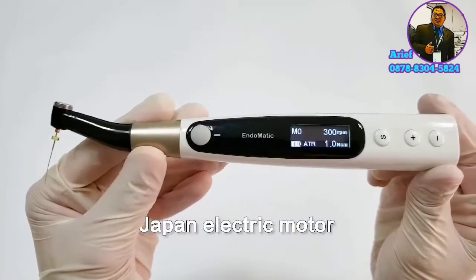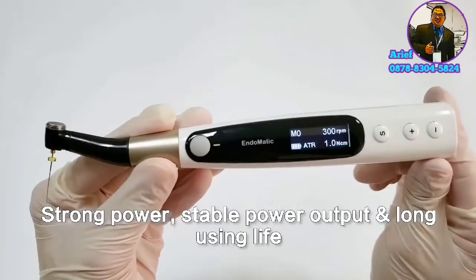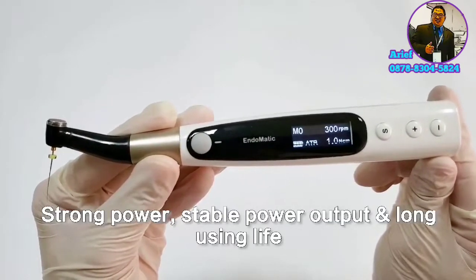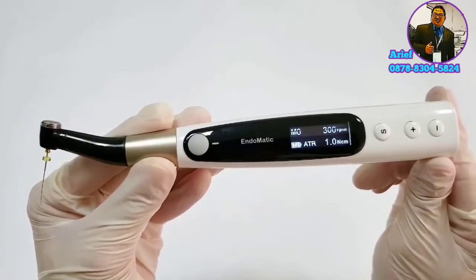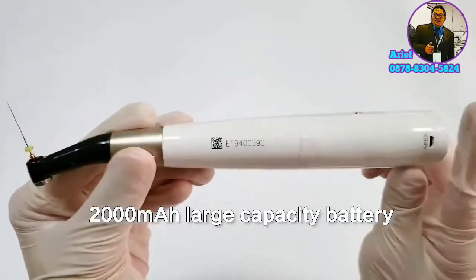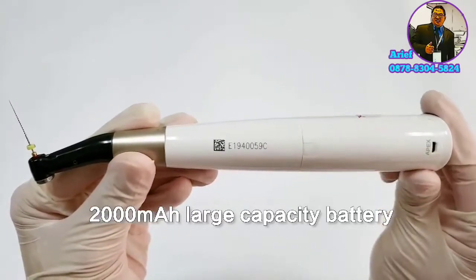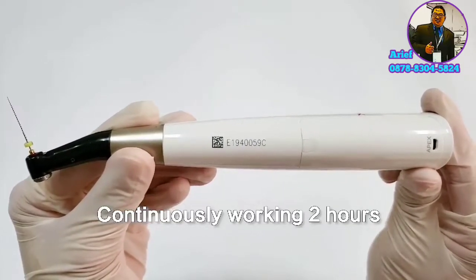Endomatic has a high-quality Japanese electric motor, thereby ensuring strong power, stable output, and long service life. In order to ensure sufficient usage time, Endomatic adopts a 2000mAh large-capacity battery, so it can continuously work for 2 hours.